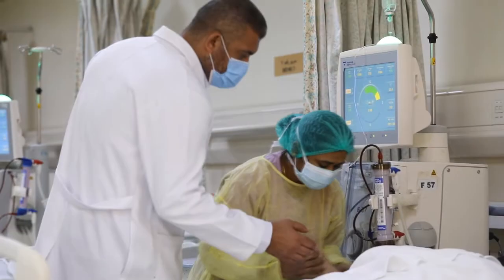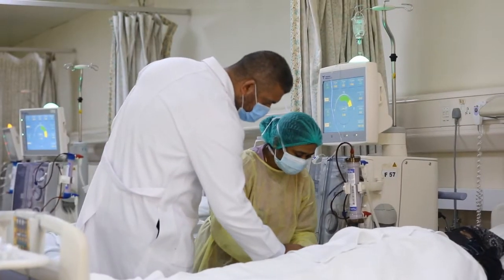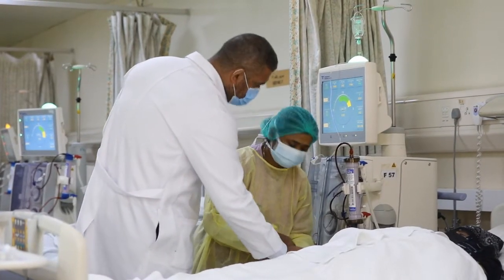We can measure the Kt/V by the use of a special program in the dialysis machine to measure the Kt/V every session for the patients. This is very nice because it can guide us to improve or modify the dialysis prescription session by session for the patients. So finally we can achieve the best hemodialysis prescription for the patient to get the Kt/V according to our targets and according to the internationally agreed upon targets, which is 1.2 or better 1.4.